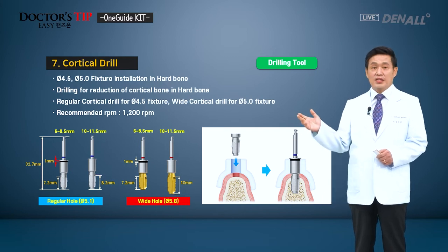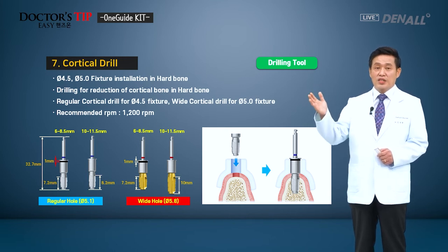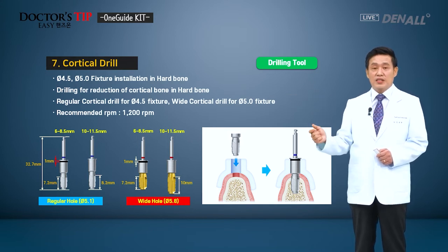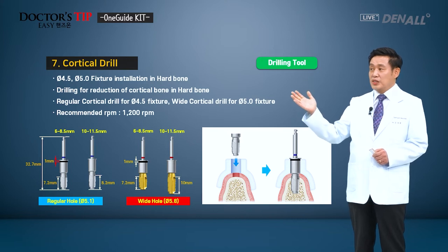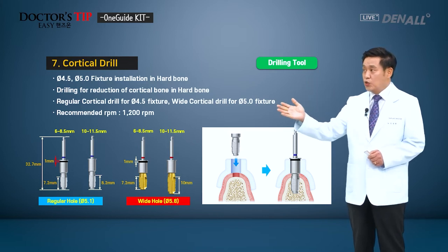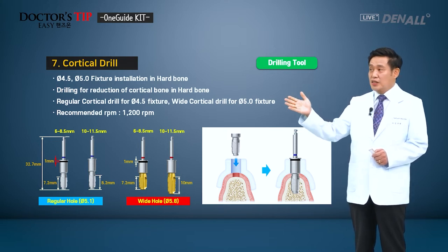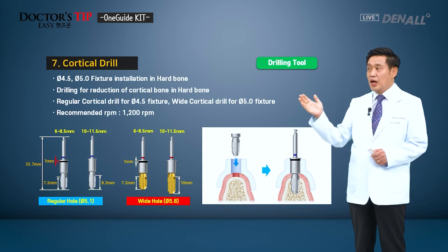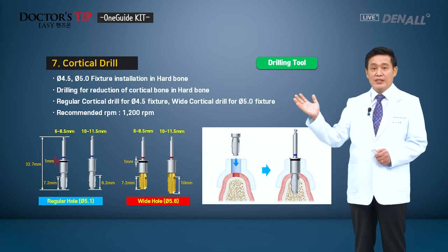Next is cortical drill. In the case of the 1-2 taper kit, for hard bone, we use the so-called fixture-sized drill, and we scale up and do oversized drilling. However, in the OneGuide drill, because there is a barrel, simply put, in hard bone, when you place 4.5 and 5.0, at times when you place the implant, insertion torque is too much and the bone is too hard. You remove the implant fixture and do cortical drilling to remove superior cortical bone in order to get the desired initial stability and prevent excessive torque. This cortical drill is the answer.